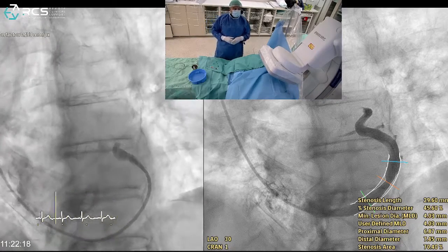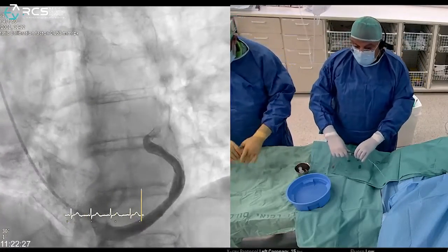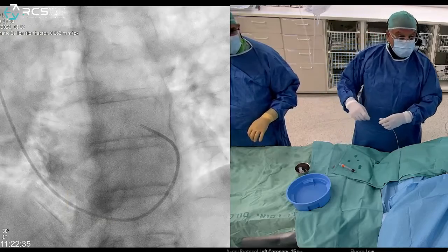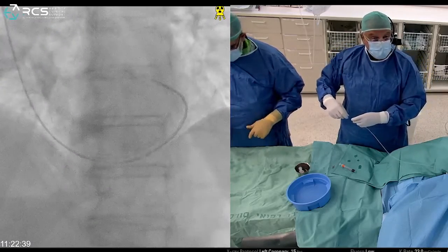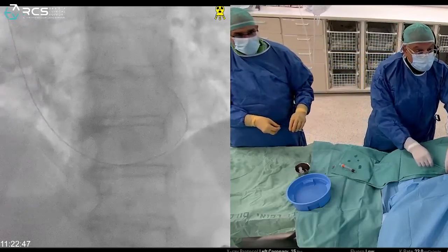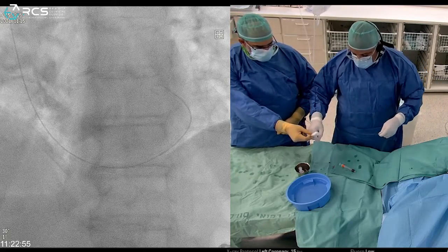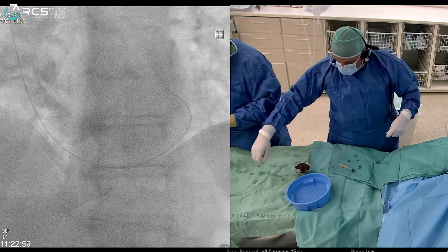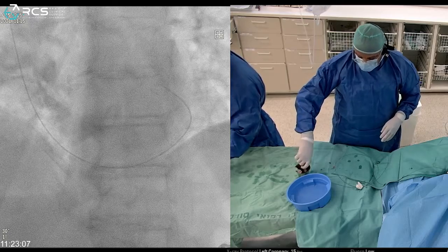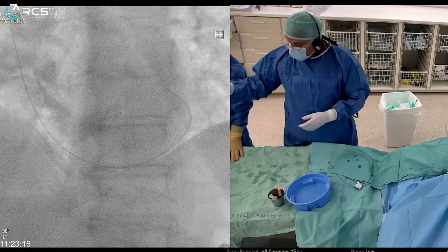We are now ready to start implantation. We give heparin. I insert the wire back into the diagnostic catheter and take out the catheter — wire going in, catheter coming out — keeping the half-circle shape configuration at all times. If I see a large belly in the right atrium, it means I'm pushing too much and need to pull back. I flush the wire and open the equipment: guiding catheter and reducer. I prepare the indiflator.